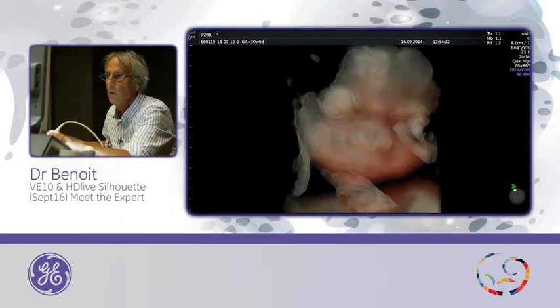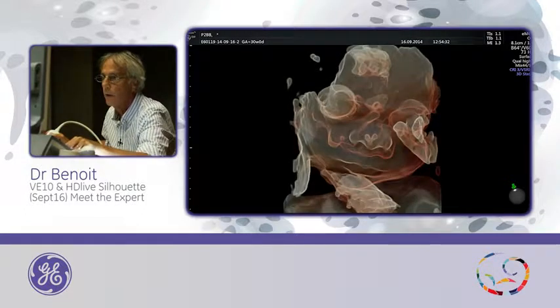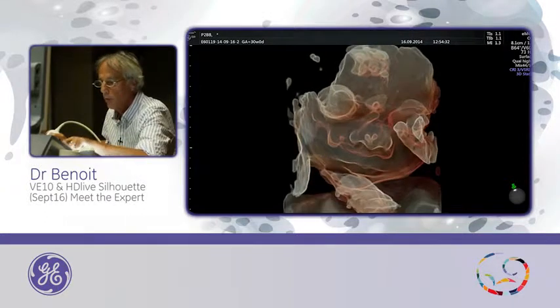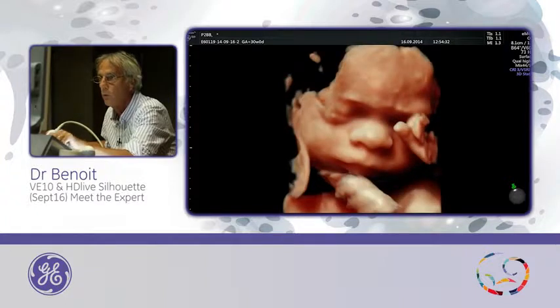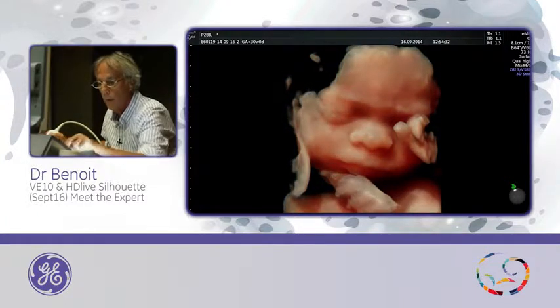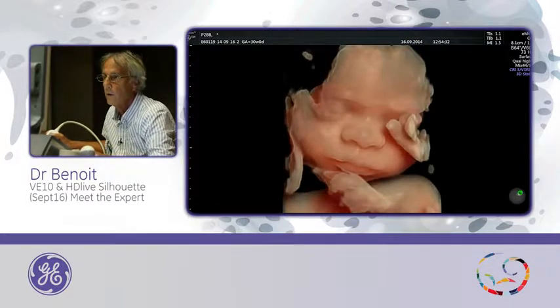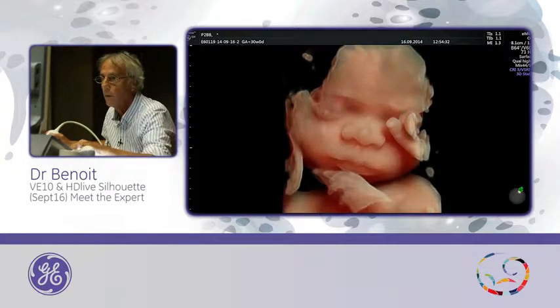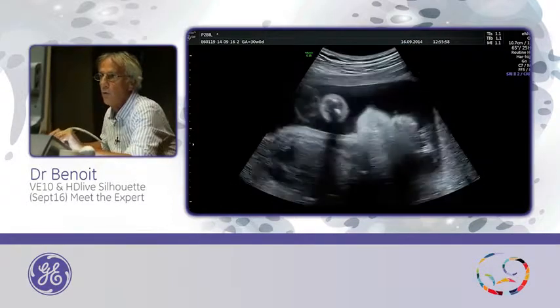This is a silhouette. When you increase the silhouette, you can see in transparency, but it's not so nice. You cannot use it like this because it's not really nice. I have to reduce transparency, but you can see the two orbits. So when I want to add the silhouette, this is without silhouette. What I do, I put silhouette, and I will reduce the transparency and also reduce the threshold. And after, you have to move the light, and moving the light, you will find a nice position.